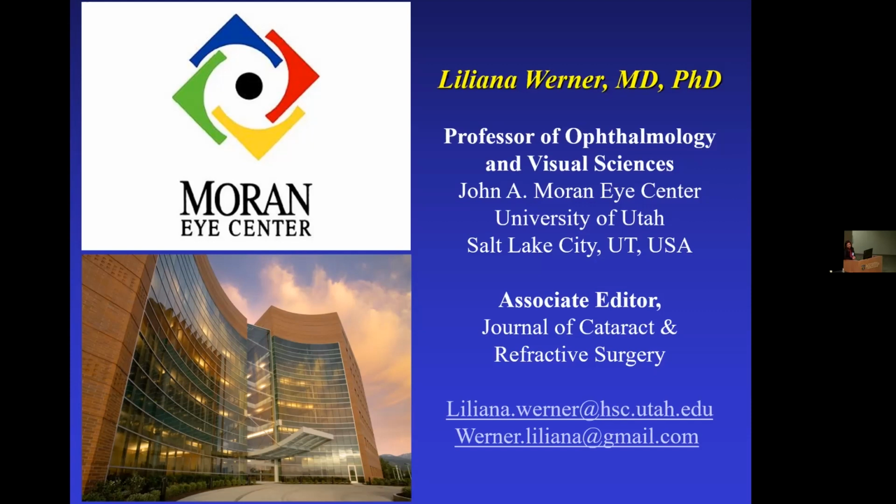So people say maybe we should all abandon hydrophilic acrylic lenses, but they are also quite biocompatible. The eye is very beautiful after implant, with no inflammatory reaction. They are very flexible. They can be used for the other applications we mentioned. So yeah, it's a balance.